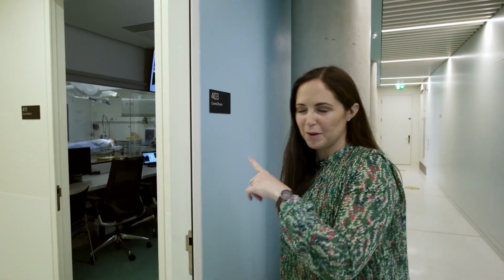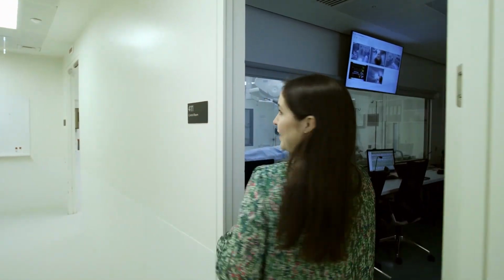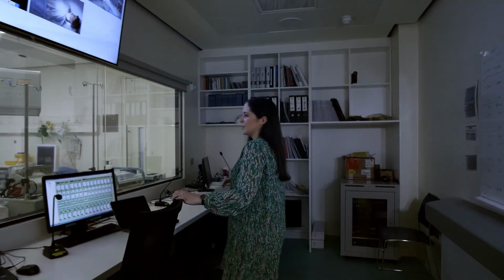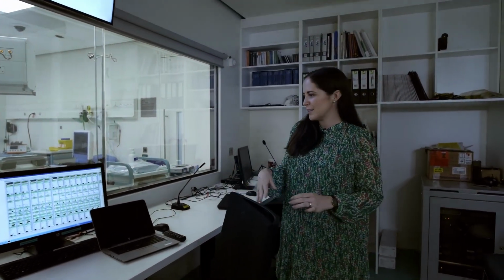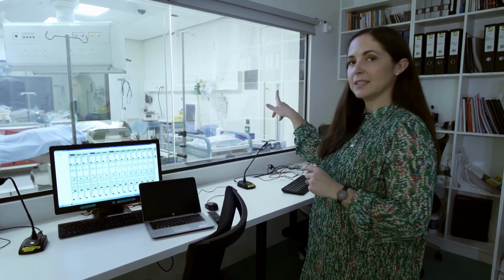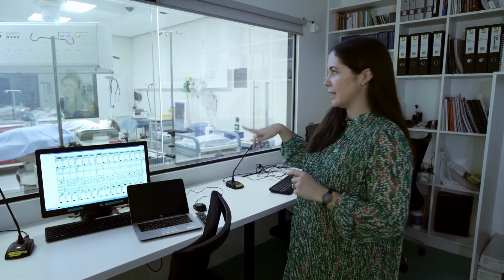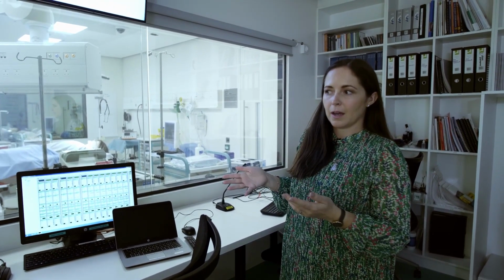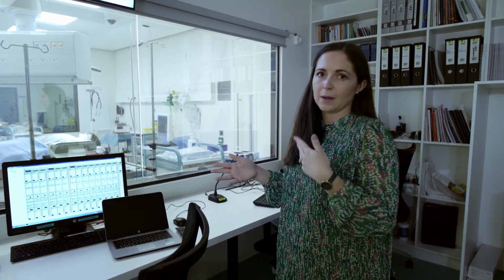Okay, so now we're going to go on into the control room, which is where the behind the scenes magic happens in our simulation centre. So this is our control room space, and this is where our technicians would sit with our control room panel essentially, and work with faculty to dictate what might be happening to a patient in a scenario. So you can see in here, we're going to go in there in just a moment, our mock operating theatre. And in there we have a patient, so we have SimMan, and we could have a scenario where the patient has come in after a car accident, where they're having respiratory arrest, an asthma attack, lots of different scenarios where students and trainees can come in and practice and learn.